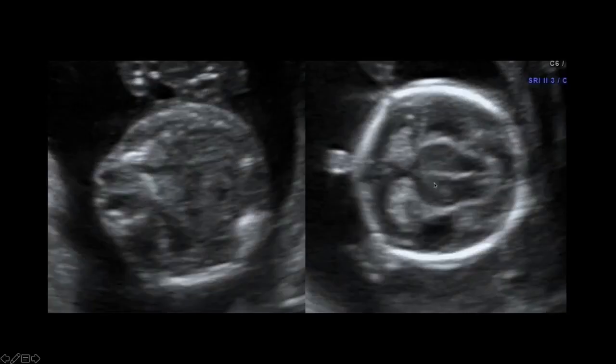Here's another one with holoprosencephaly. This one has a proboscis. And in this case, the two orbits are very close together. They're probably, the two globes are probably in the same orbit, maybe cyclopia, or at least very close to that.